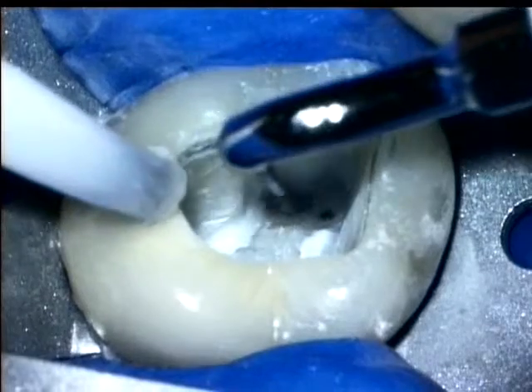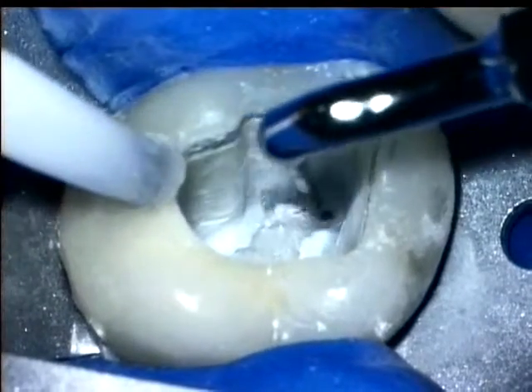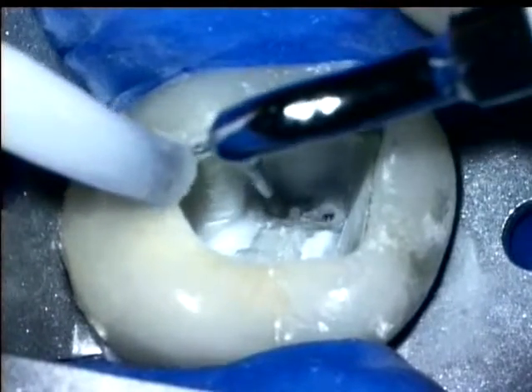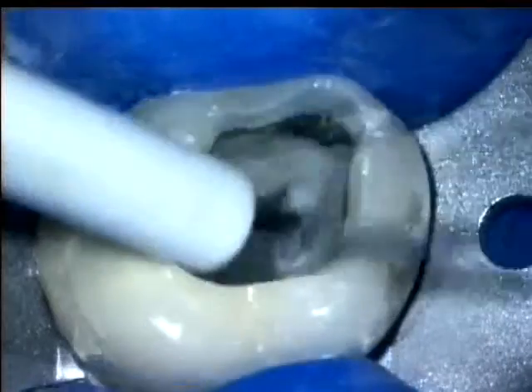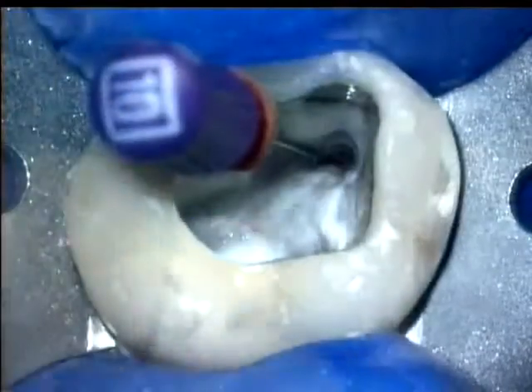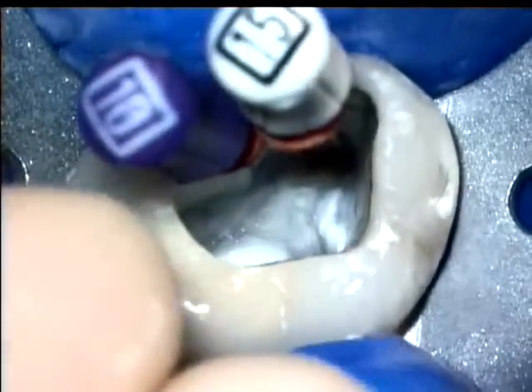The Pro-Ultra Endo tip number 3 is used at low power. The tip is brushed back and forth exposing the orifice. The placement of hand files confirms the separate orifices.